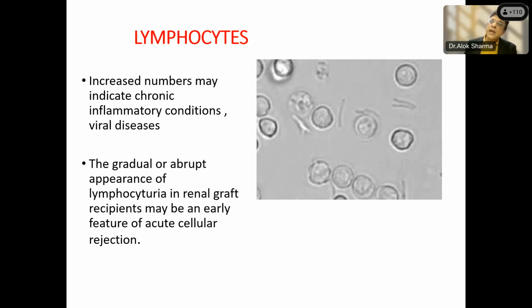Even I've seen personally in cases which I used to see, you do get a lot of lymphocytosis, at least along with the renal allograft rejection. And if you do a careful serial examination, you can actually pick up or predict allograft rejection in some cases, at least by looking at the lymphocytes in urine. So this is another utility of doing a good urinary examination.